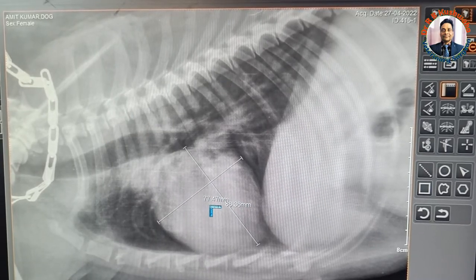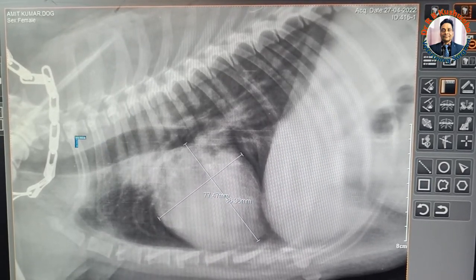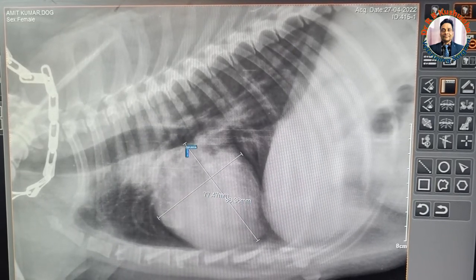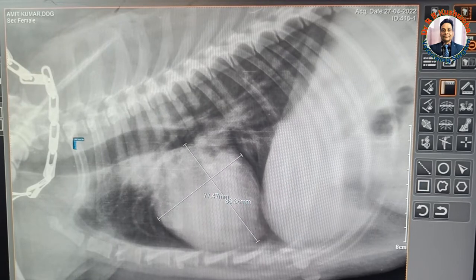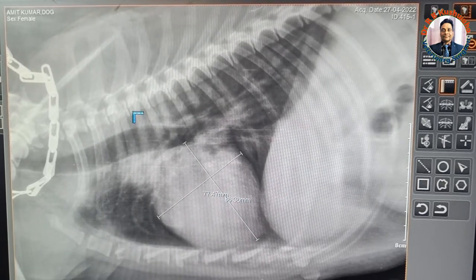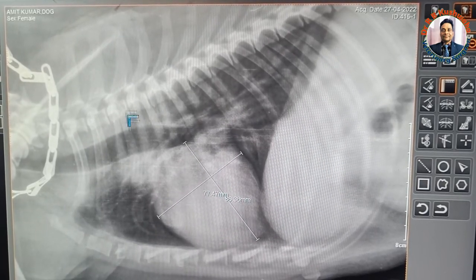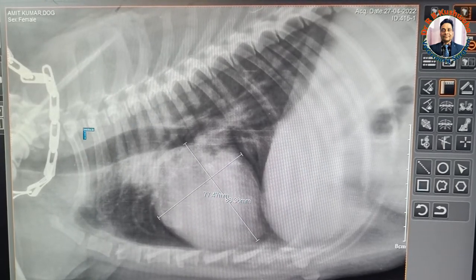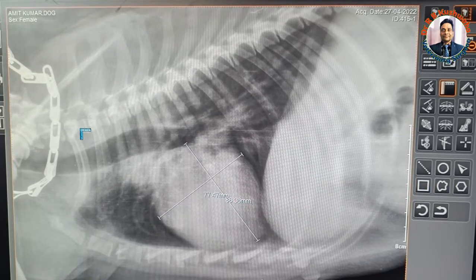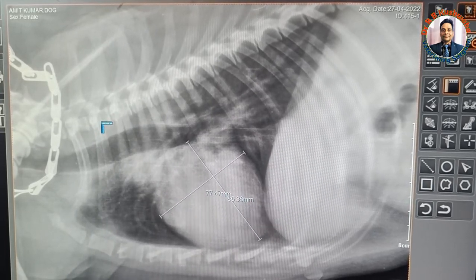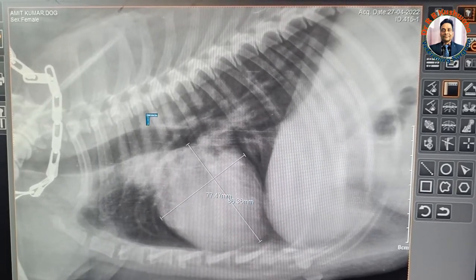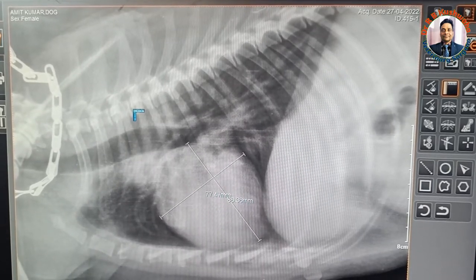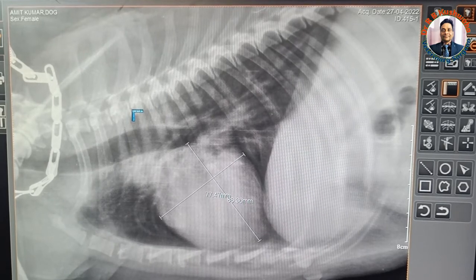We measure this long axis and short axis in relation to the vertebral body, starting from the cranial border of the fourth thoracic vertebral body. To identify T4: this one is the first thoracic vertebral body, this is the second, this is the third, and this is the fourth thoracic vertebral body — and this is its cranial end plate.